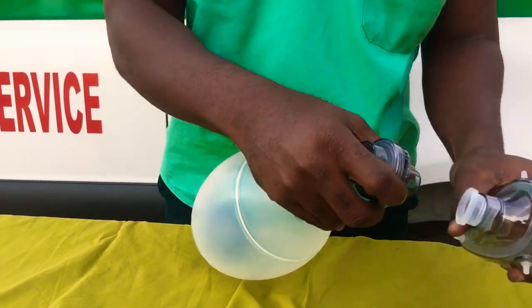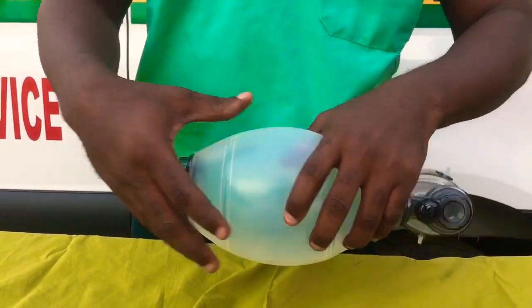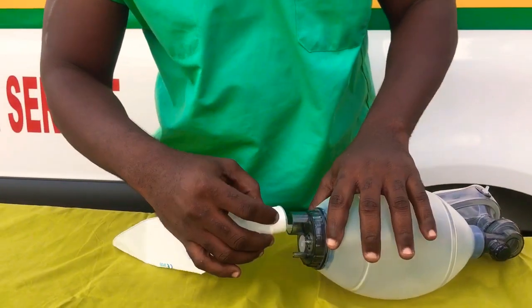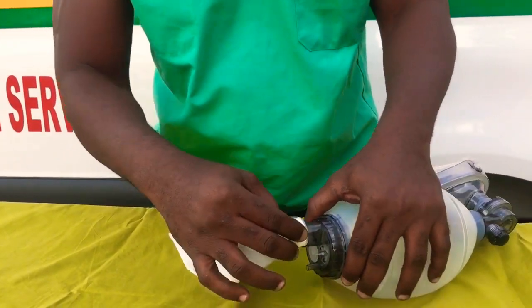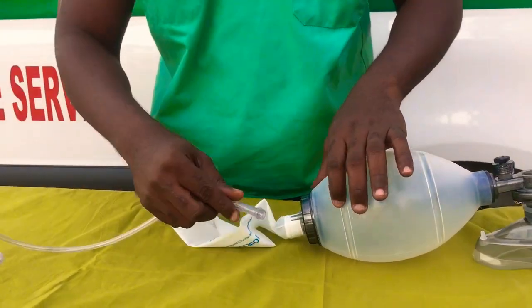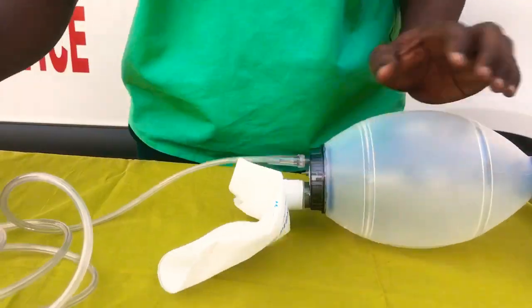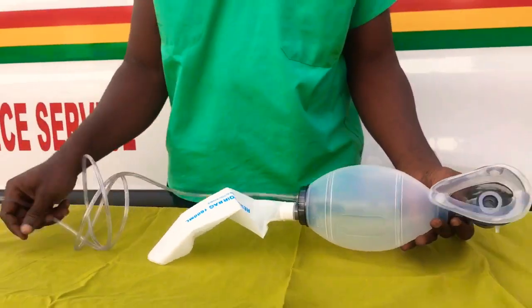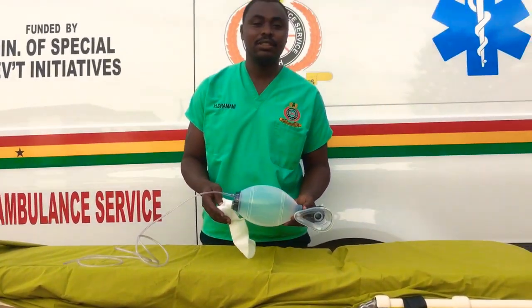Then we connect the mask to it, connect the reservoir to the air inlet here, and then the oxygen connecting tube will be connected to the oxygen inlet here. And then we have our BVM fully assembled. Thank you very much for watching this video.